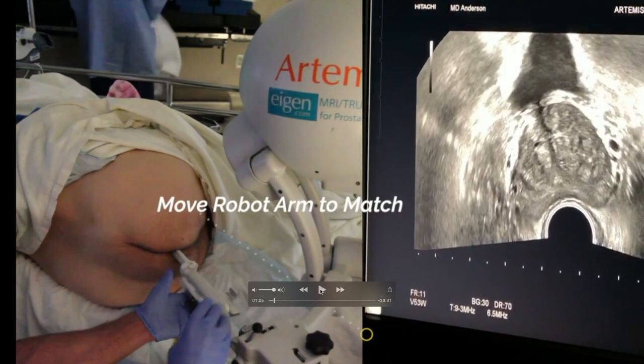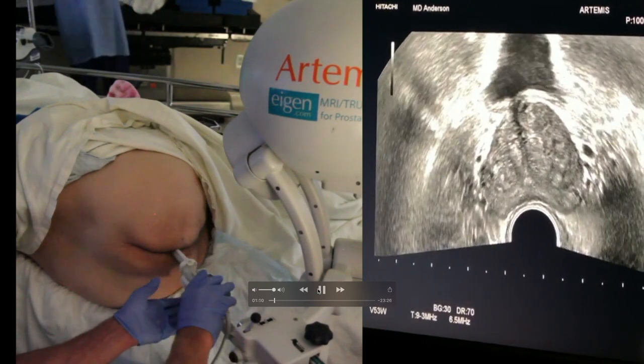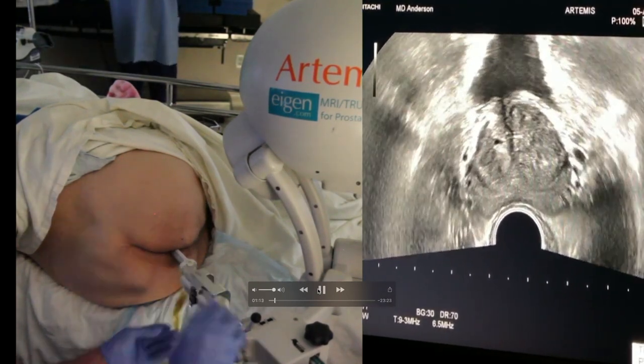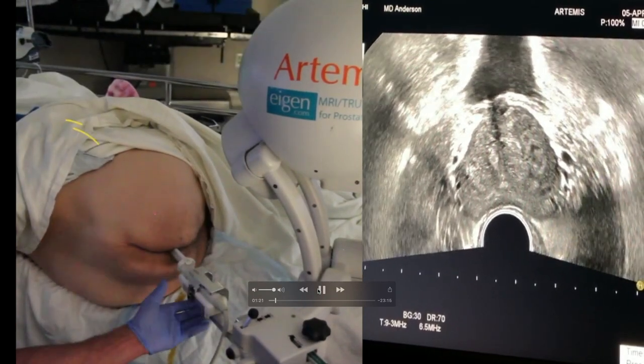One of the things people complain about the Artemis device is the use of this mechanical arm as opposed to having it in your hand. But after you get over that, I think it's simple. There are a couple of tricks to quickly dock it. I'll do up to 15 of these biopsies in a day under sedation, and just as Dr. Marks said, it takes about 15 minutes, even with the docking of the robotic arm to the ultrasound probe. You want to put the ultrasound probe right where you want the image to be obtained from the prostate, and then move the mechanical arm to match the ultrasound probe—not the other way around.